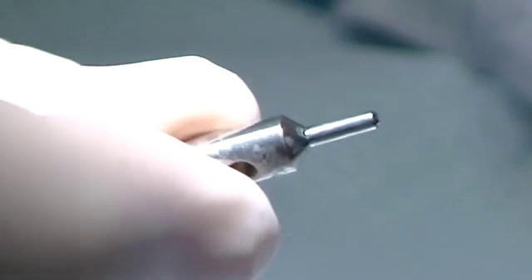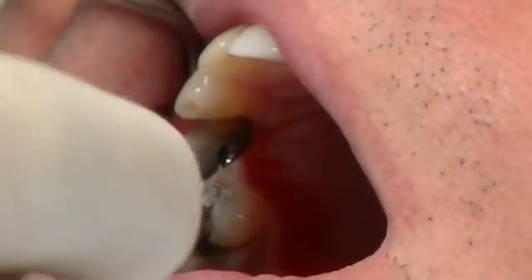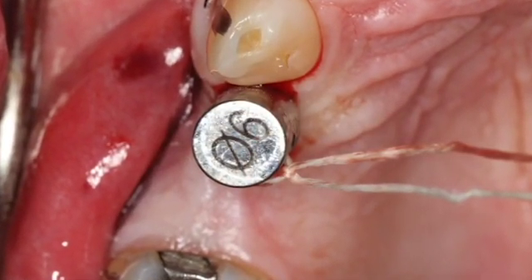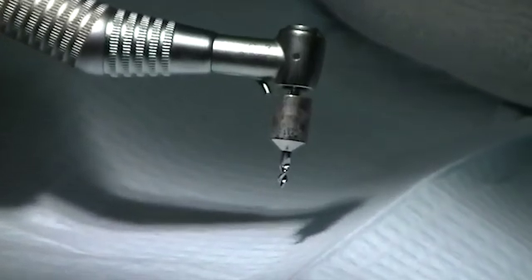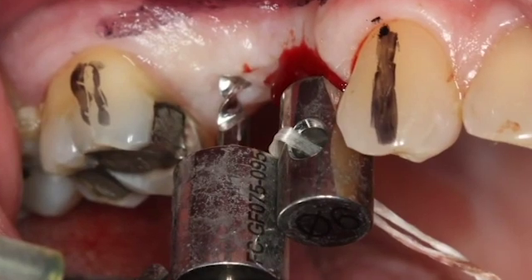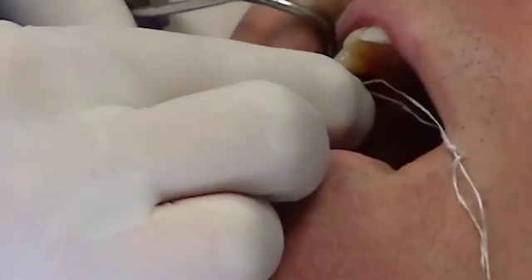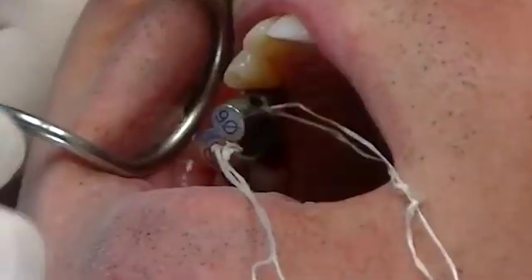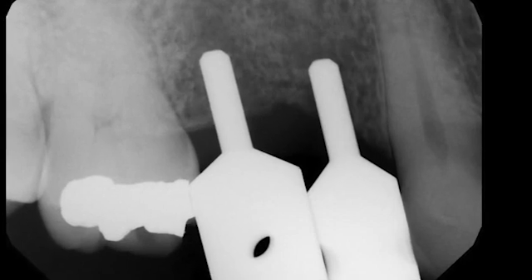So we have a space and we have to determine what size teeth we're going to be able to place. We then have the same size cylinder post that will engage into that preparation. I tie some floss around it so we don't lose it, and you can start to virtually see what that tooth is going to look like before moving any further — you're able to position the patient and teeth correctly. Then we do the same thing with the second tooth, splitting the difference, using the pilot drill and setting the cylinder in place, making sure we're happy with positioning: minimum two millimeters from adjacent teeth and three millimeters from adjacent implants. You can see here how the final crowns will be positioned correctly in that edentulous ridge.